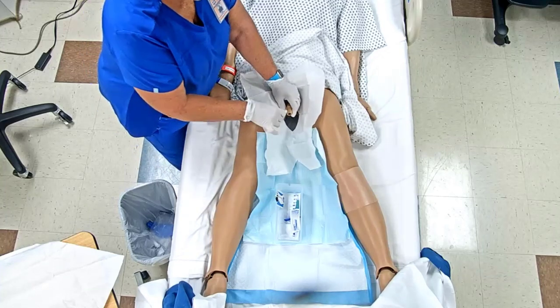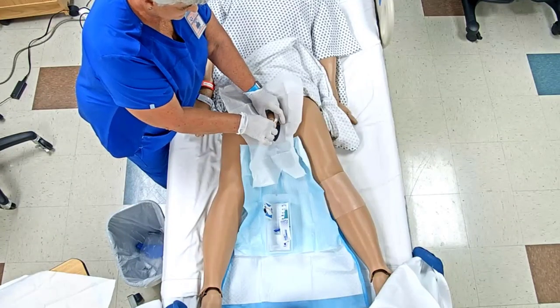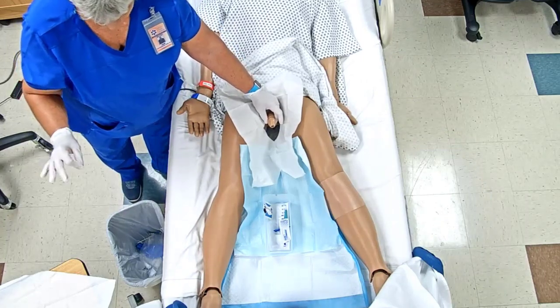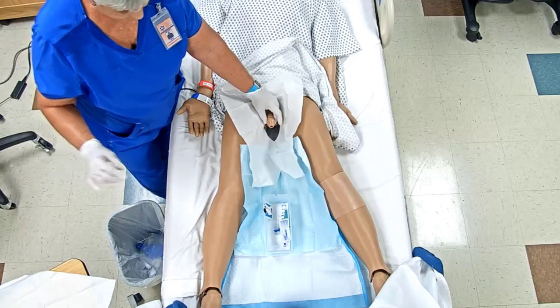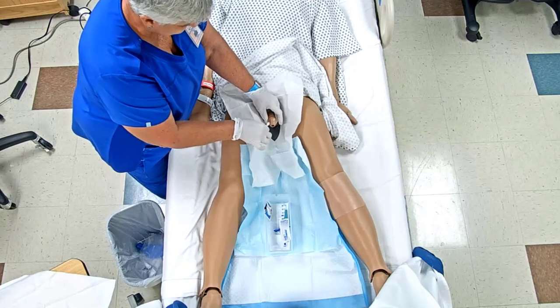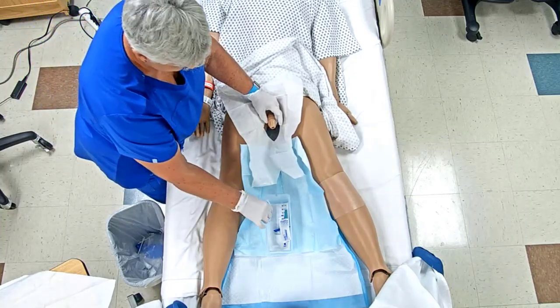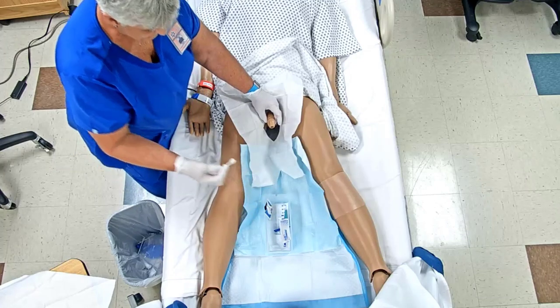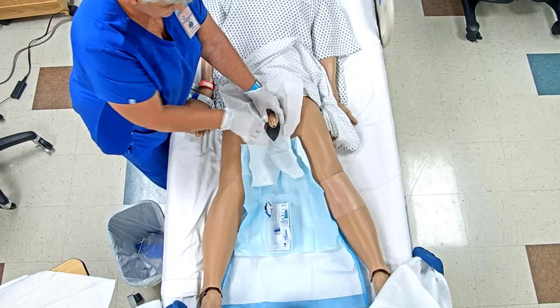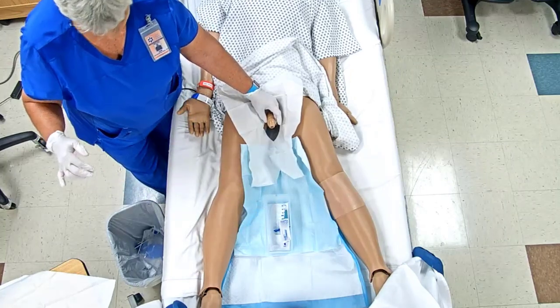Bring it up. We're going to start at the meatus, and we're going to work towards the glans. We're going to bring it out, and we're going to drop it. You see I kind of step back so that my hand is still within my view, and I'm not going down below my waist here, okay? Okay, so again, start at the meatus. We're going to step back, drop. Okay, we're going to start at the meatus. We're going to work around to the glans, and we're going to step back, drop. Okay, so that part is over with.